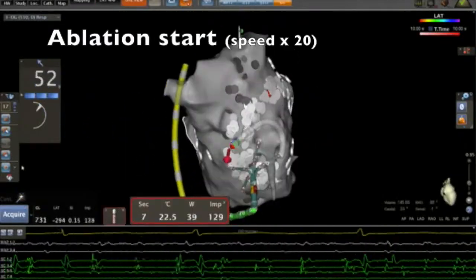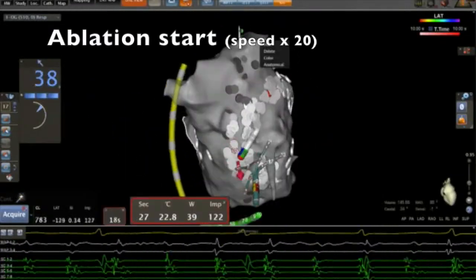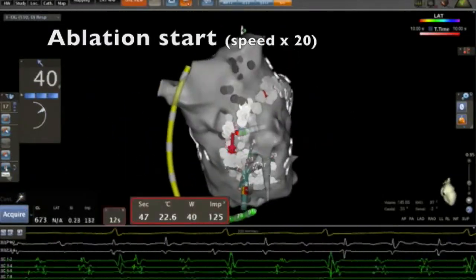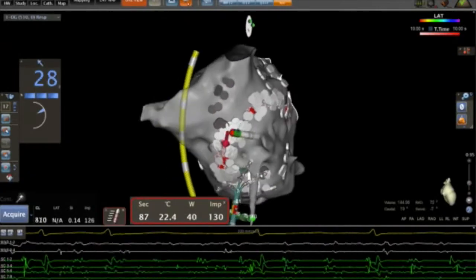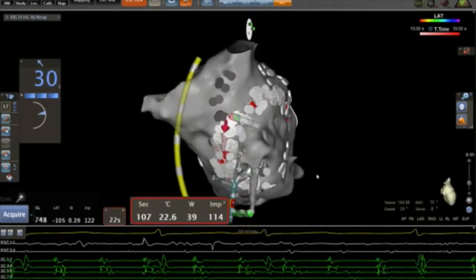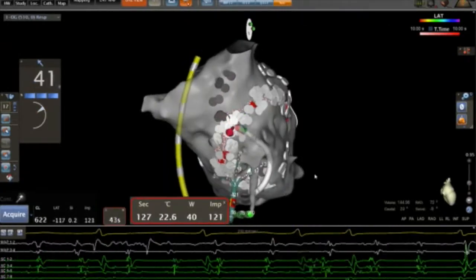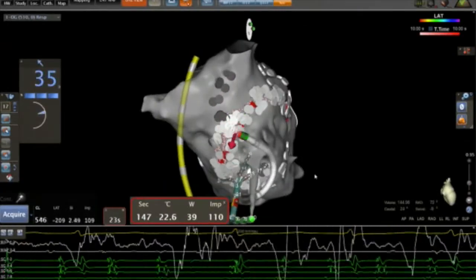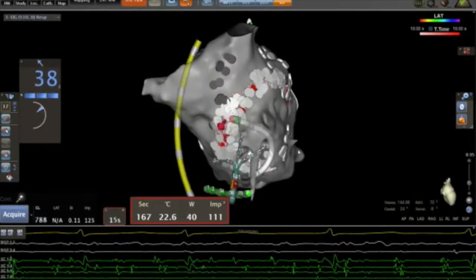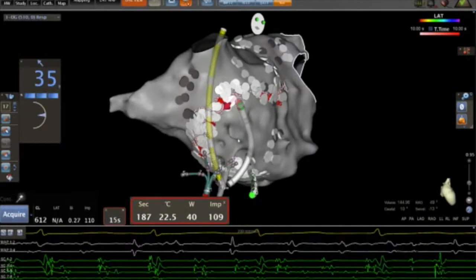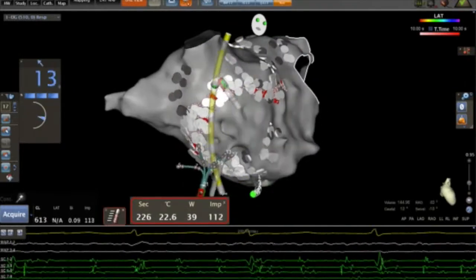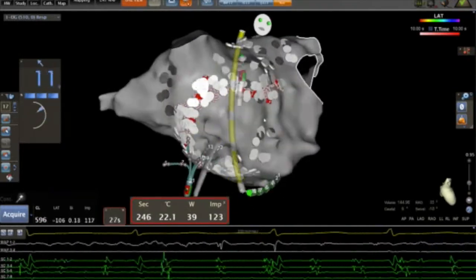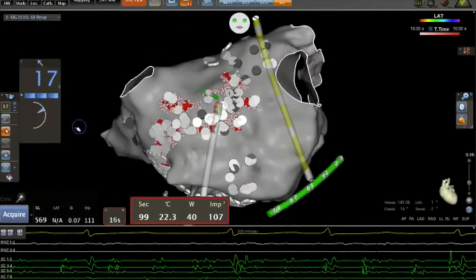Then we start the ablation on the entire wall of the left atrium, here on the septum, using 40 to 45 watts. We try to achieve good contact superior to 10 grams.